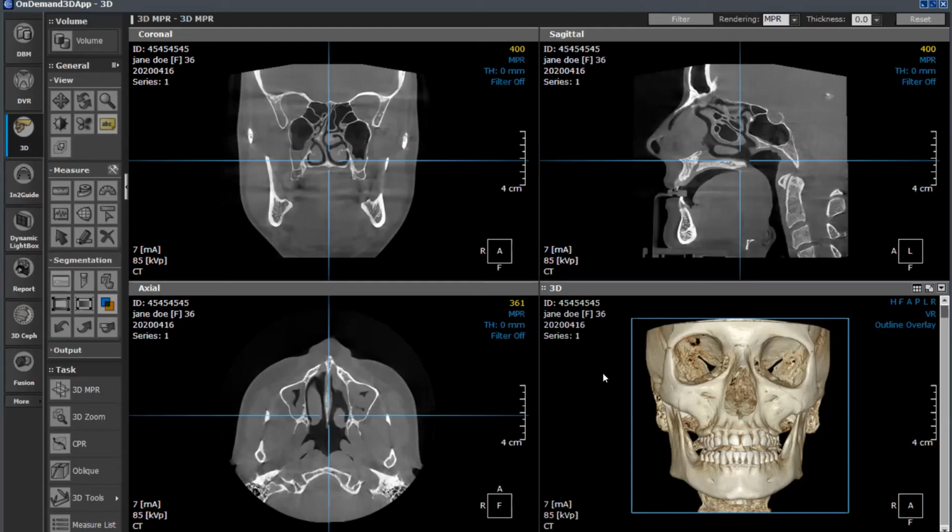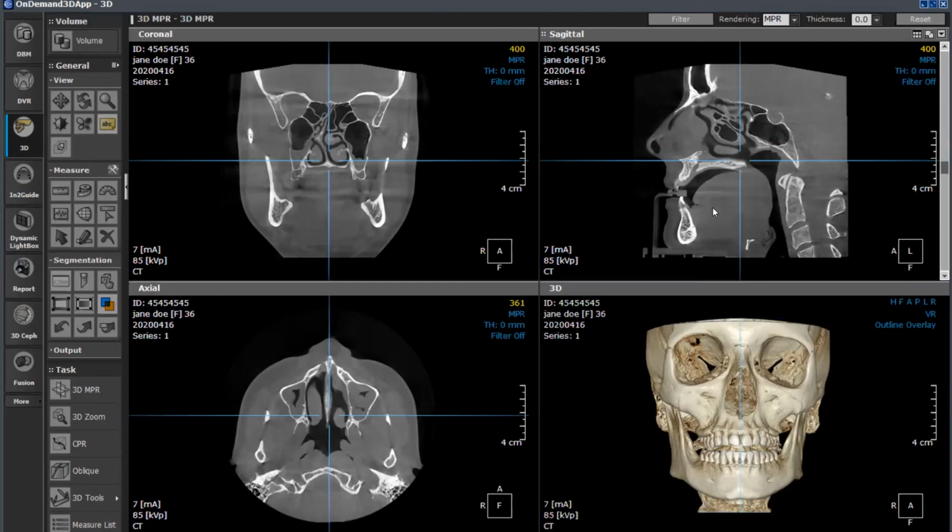So a lot of this out there is a lot of interesting marketing associated with people saying that they can do a number. But when you actually look at the images they create from it, because they're looking for smaller and smaller voxels, they may not get the image quality that you're getting with this size voxel, primarily because you get such a signal to noise ratio that even any algorithm is going to have a hard time interpreting that. So we chose to keep ours at 0.1 so that we are able to give you the most information and the clearest information we possibly can without that distortion.